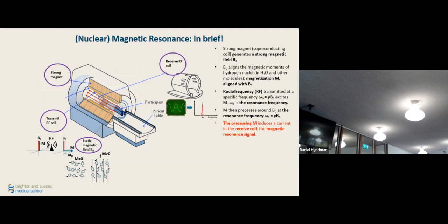And if we take the evolution in time of this oscillating current, which is at the frequency omega naught, and we do a Fourier transformation, or we represent this oscillation in the frequency domain, then we get a kind of concentration of energy, or a peak, at the frequency omega naught, which is our Larmor frequency. That's the whole story. That's magnetic resonance. We can stop here. And this is your first spectrum of those resonating protons that gives us a single frequency, omega naught.